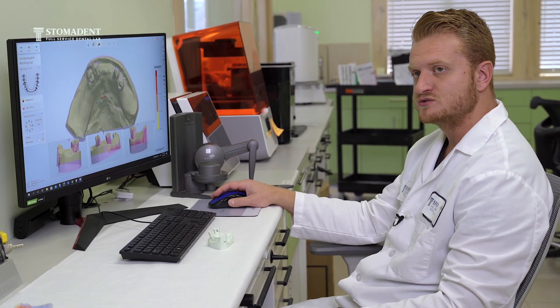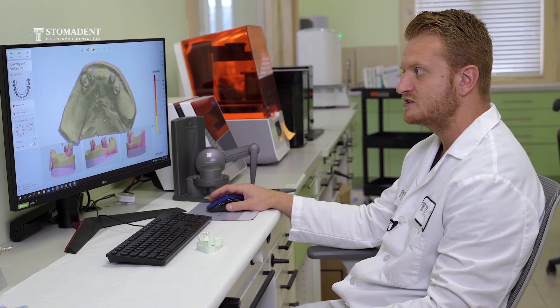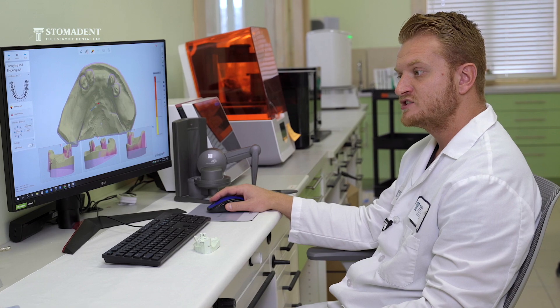Hello, my name is Anton and I have been working for Stoma Den Dental Lab for over six years. I am the current manager for the metal department and it's very interesting to see how much digital design and digital frameworks have changed in the past five years.